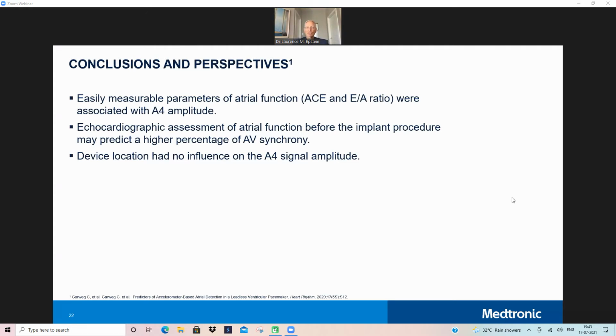Often these patients are frail. We have a lot of little old ladies that have no soft tissue or no place to put the device, or even getting access is challenging. You don't have the issues of device erosion or pocket infection, and it seems to work quite well in that population. And I know there's going to be more discussion about patient selection, but I think that is a really, really important part of the Micra AV rollout for everybody to have a good experience with using it.